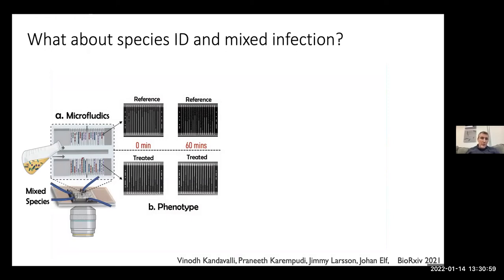What we are doing now at the lab at university is taking this one step further so that we can do species ID also in the test, and also mixed infections. So in this case, you would have a sample with different bacteria inside.